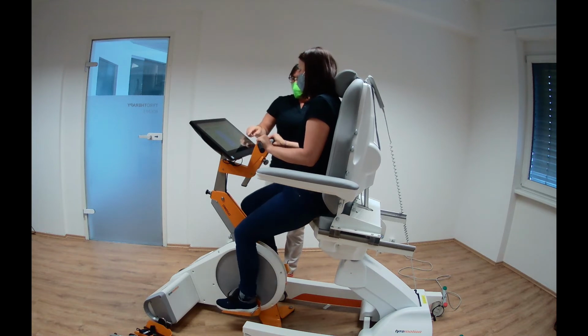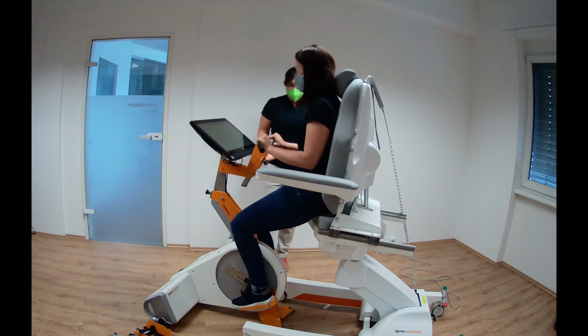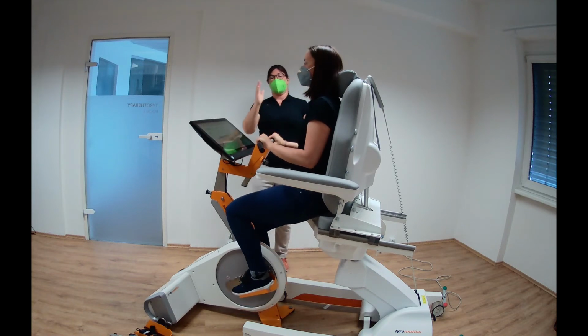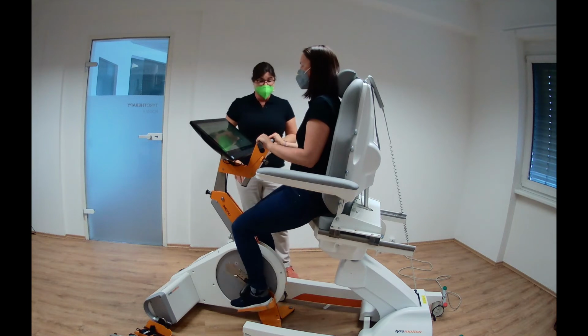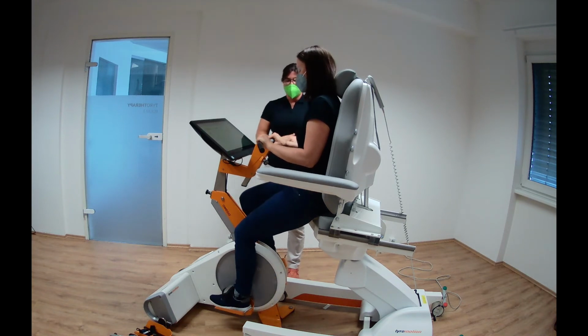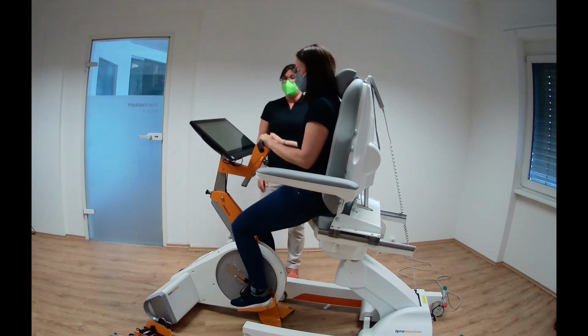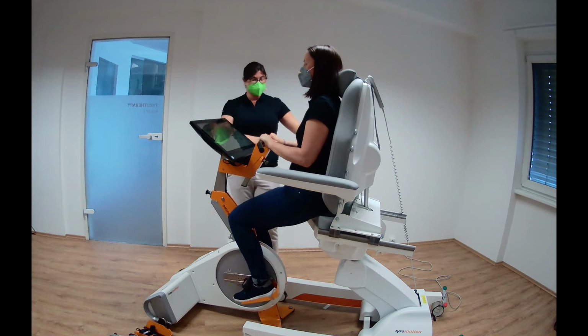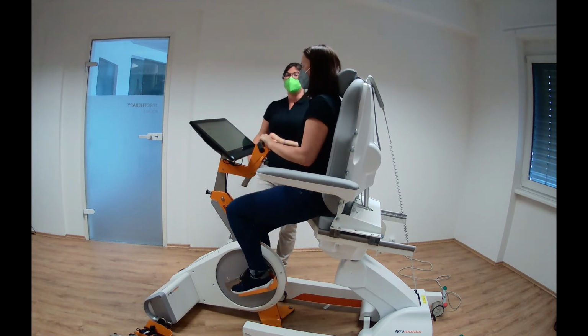All right, so this is the stepper movement in a verticalization. Of course, we could even lift her higher, we can bring her closer, we can focus more on a hip extension. So we have a lot of options how we can increase the range of motion or how we can adapt all those settings to her needs. On the other hand, keep in mind, we can do the same movement in an almost sitting position. So this is where we would focus more on the hip flexion, for example.